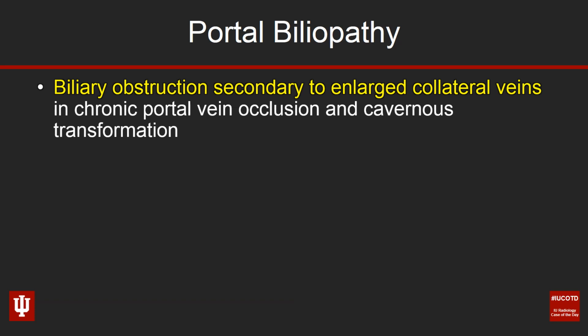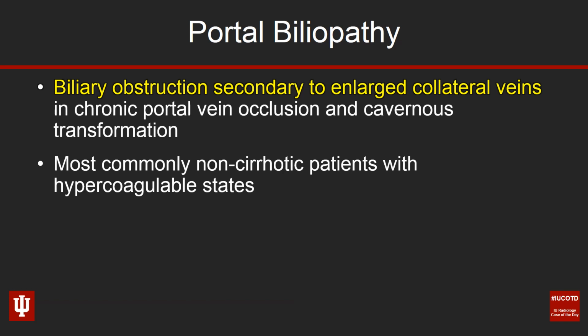Portal biliopathy refers to biliary obstruction secondary to enlarged collateral veins following chronic portal vein occlusion and cavernous transformation. The enlarged veins cause extrinsic compression upon the bile ducts. This condition most commonly occurs in non-cirrhotic patients with hypercoagulable states, rather than patients with cirrhosis. This is reflective of differences in the development of collateral flow.